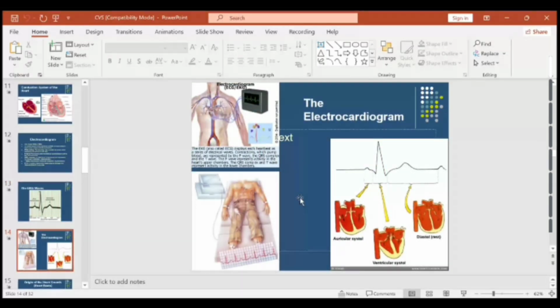So as a procedure for ECG tracing, we use a 12-lead ECG, which I hope by the time you went to your lab practicals you have been taken through. And if you have not been taken, don't worry. At the hospitals, you have the ECG machines, and it's a skill that you learn as part of any other nursing procedure. Doing it is one thing, but learning how to interpret it is another thing. But simply knowing how the heart operates forms the basis of it.